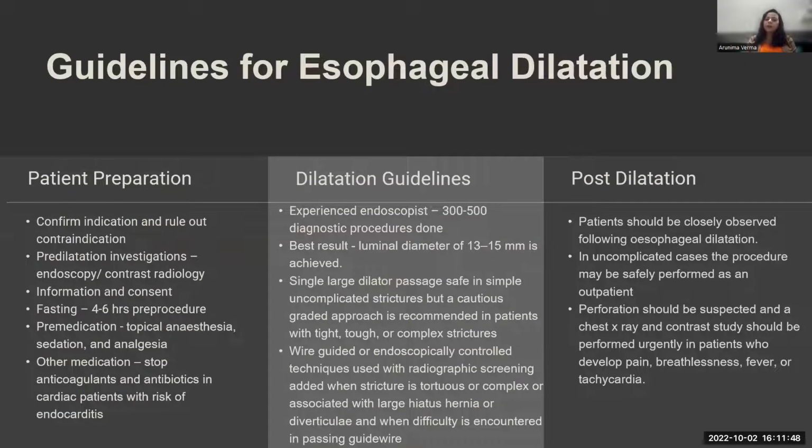However, balloons need frequent replacement because they do burst. Looking at the guidelines for esophageal dilatation, 3 parts are very important: patient preparation, dilatation guidelines, and post-dilatation care. So in patient preparation, confirmation of indication and ruling out contraindication is primary.